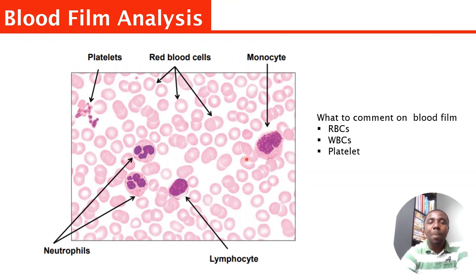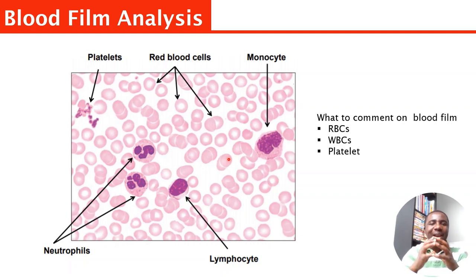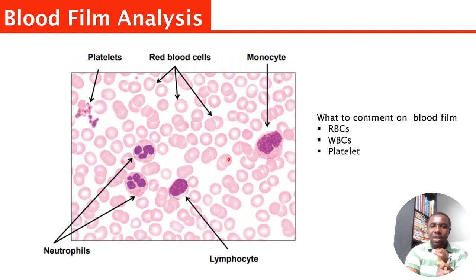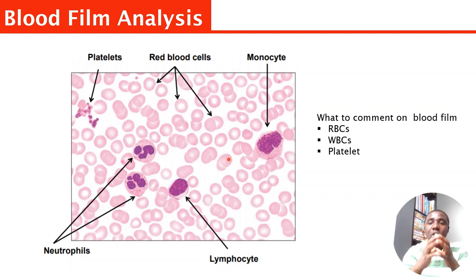This is normal blood cells. You can see normal red blood cells, platelets — those small dots — monocytes, neutrophils, and lymphocytes. Now, when they give you a blood film to comment on in your interview, it's very vital that you comment on all three cells: comment on the red blood cells, comment on the white blood cells, and also comment on the platelets. Don't get distracted — you need to comment on all three.